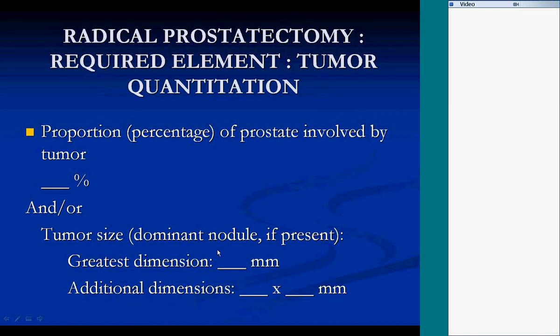Alternatively, if you can identify a dominant nodule, and it's not always possible to do so, you can provide a tumor size in the greatest dimension of that nodule in millimeters, and in 2 dimensions if you so desire.